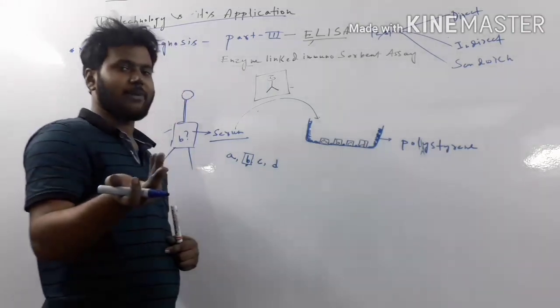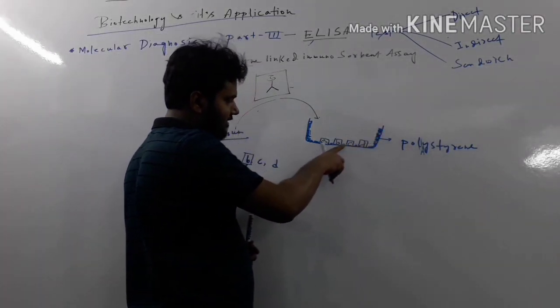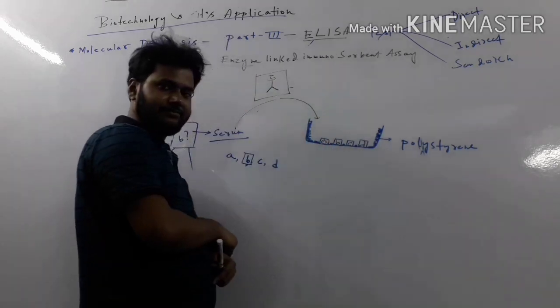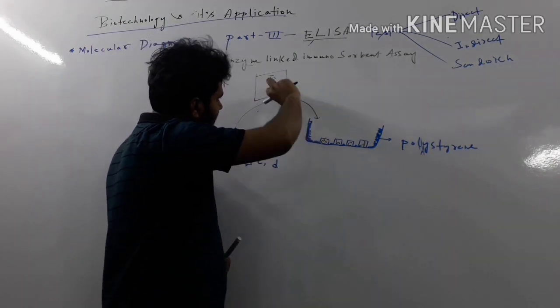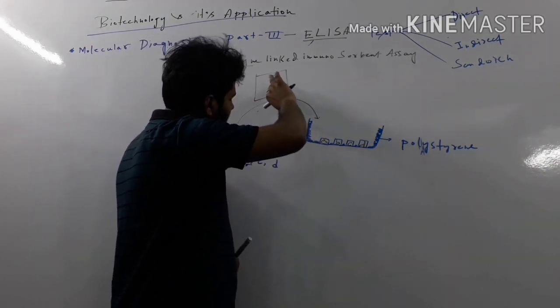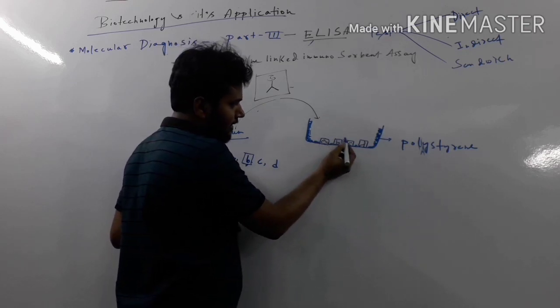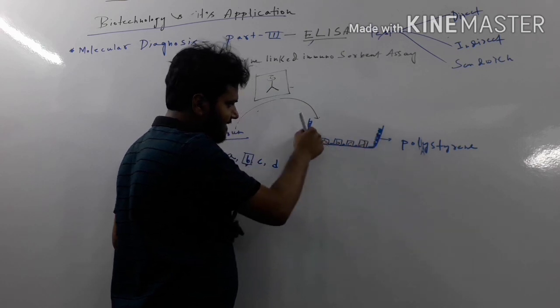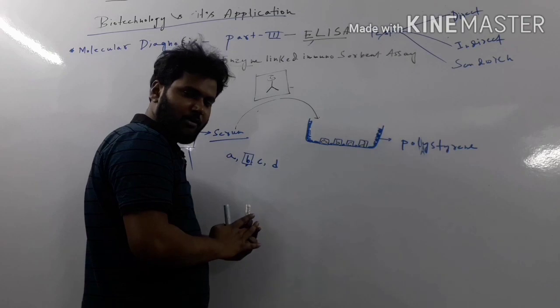It is one type of chemical that blocks all the surfaces of this polystyrene plate. So now if we deposit the reagent here, a reaction is possible only here and here. In these places, as they are blocked by chemicals, no reaction will be possible.